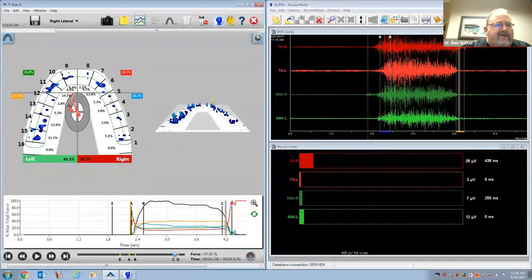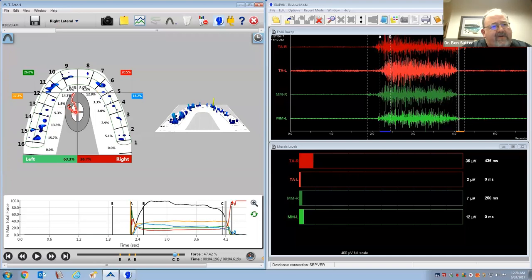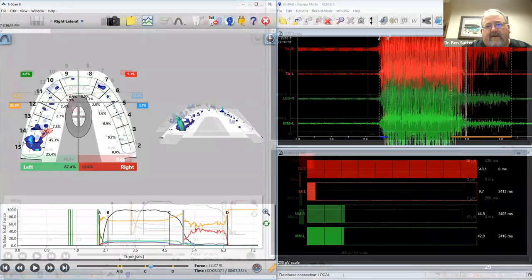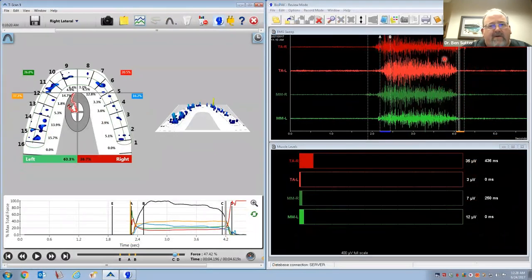Here she's not perfect but she's on her way. It's a right lateral movement, and you expect when she goes into right working, the canine is going to take over — and it's doing that. But look at what the muscles are doing. Remember she was at 350 microvolts before. Now the muscles are much more calm. And her migraines are actually better.